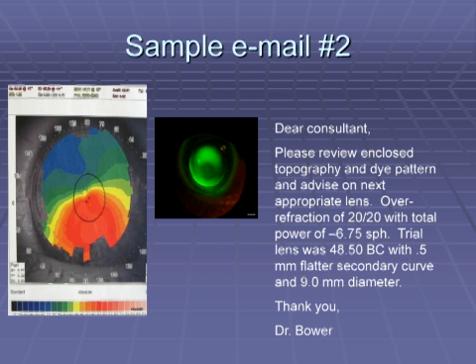At the end of the day, the video was reviewed in detail, including slow motion, and the final lens ordered. If there had been any additional concerns, the still photo or video and topography would have been emailed to the contact lens consultant for further review.